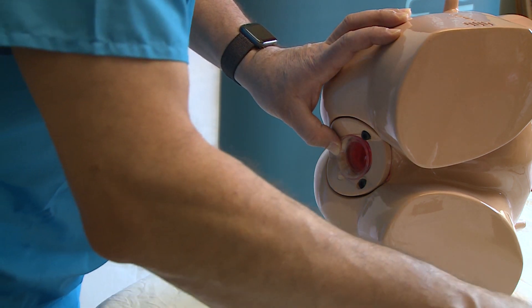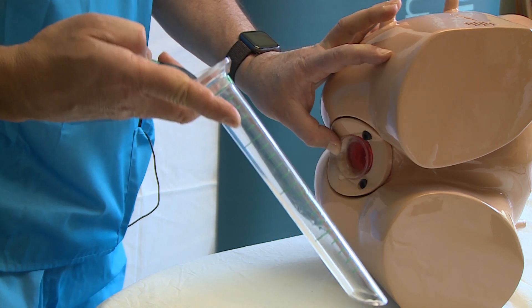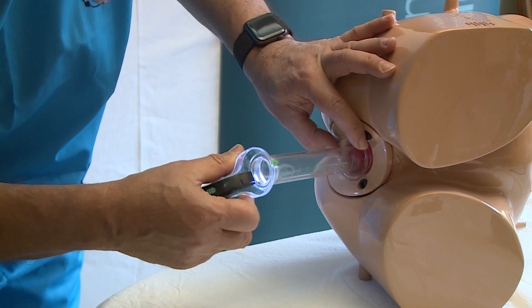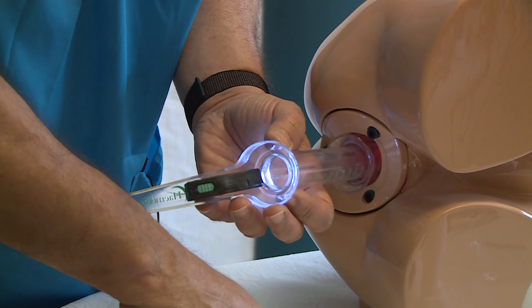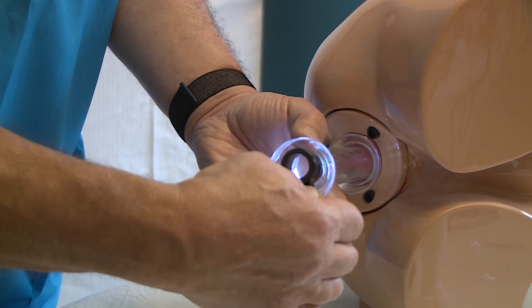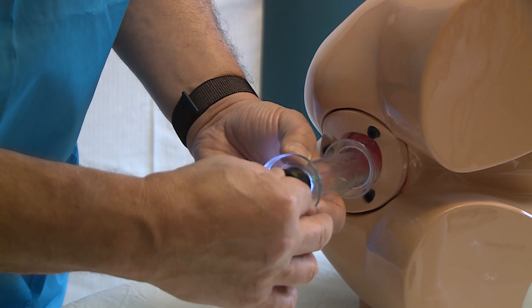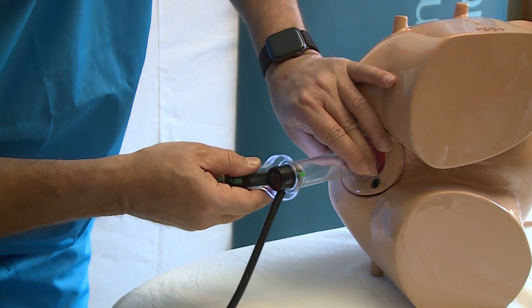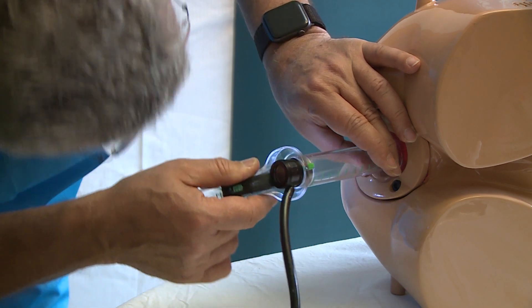We attach the handle to the sigmoidoscope, turn the light on, and introduce it through the sleeve. The patient will not feel it going in because of the sleeve. The air pump and lens module are positioned with the air pump at 3 o'clock, as there is an indentation to accommodate the light module. The pump is then used to inflate. The scope can be introduced, withdrawn, or rotated fully without causing patient discomfort due to the sleeve.